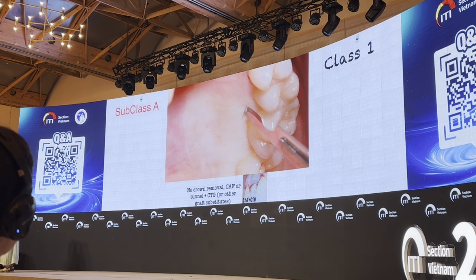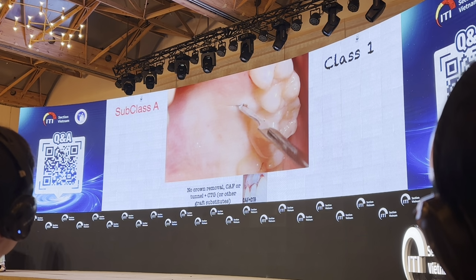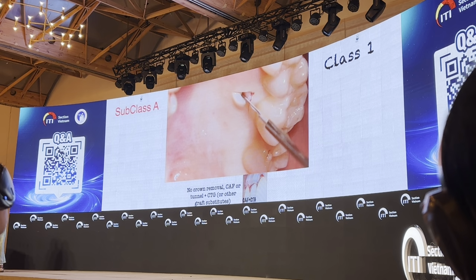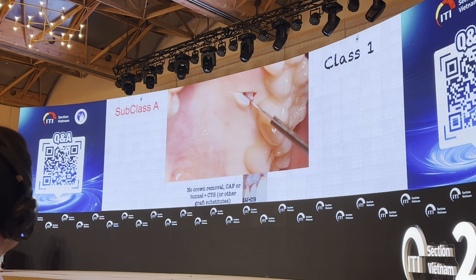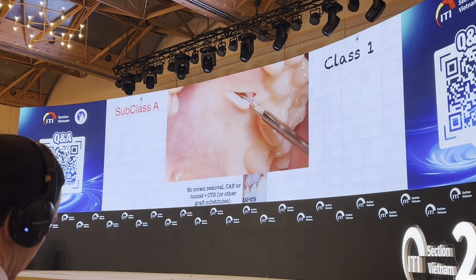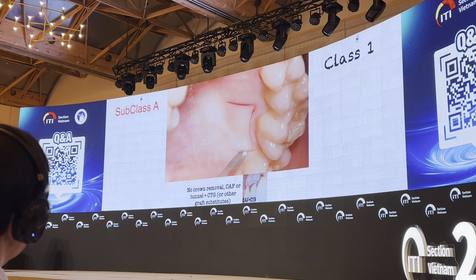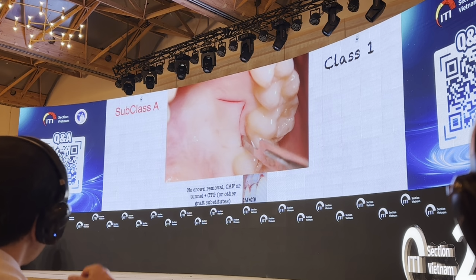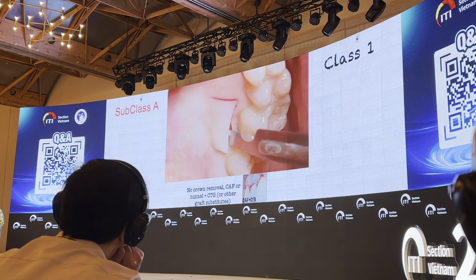I just have to coronally advance my flap to cover completely the connective tissue graft that is going to increase the soft tissue thickness, masking the transparency and improving the emergence profile of the implant-supported restoration in the supracrestal portion of the soft tissue.